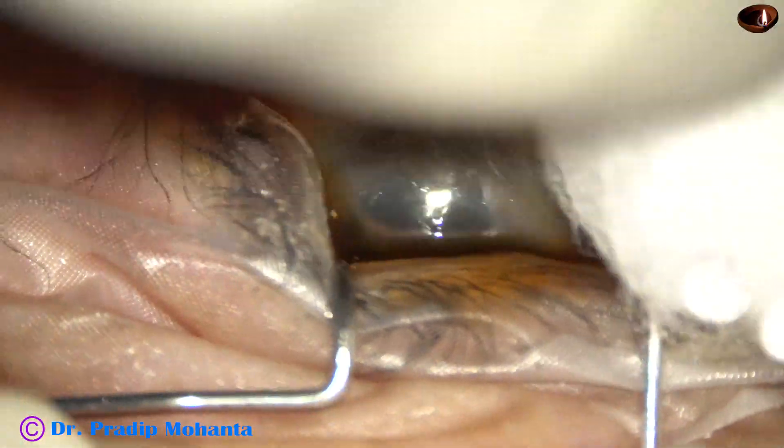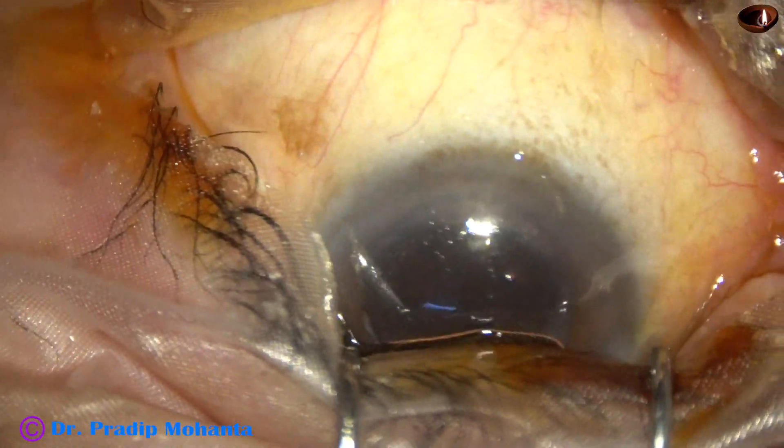And now the ocular surface is thoroughly irrigated.